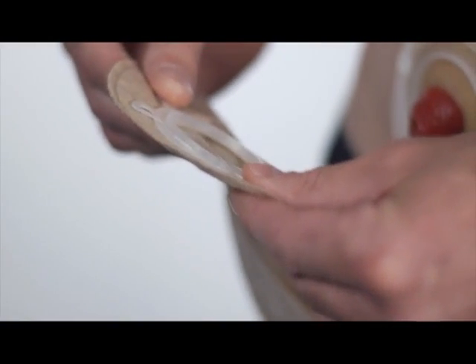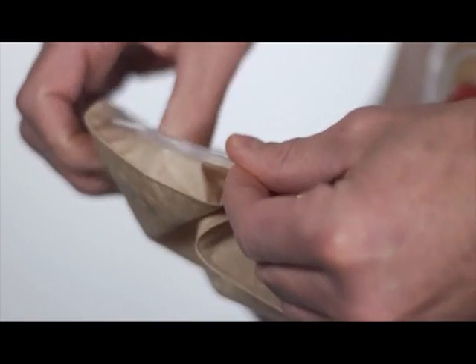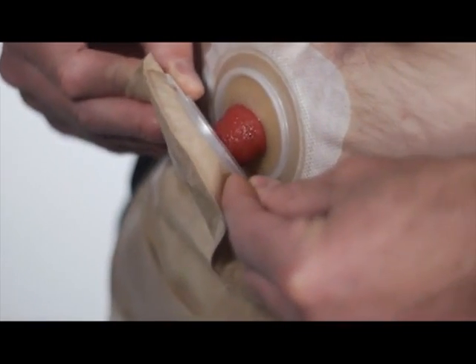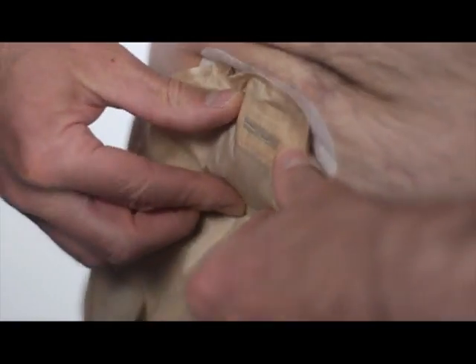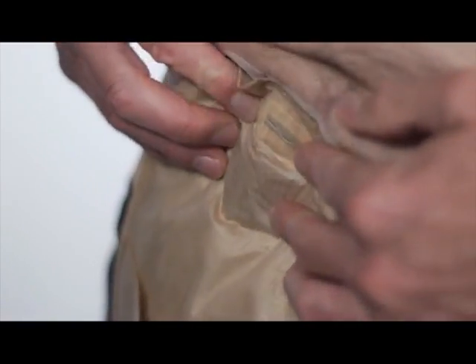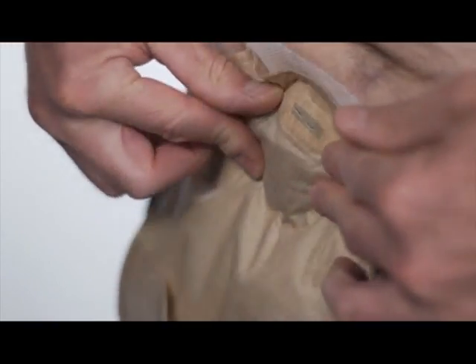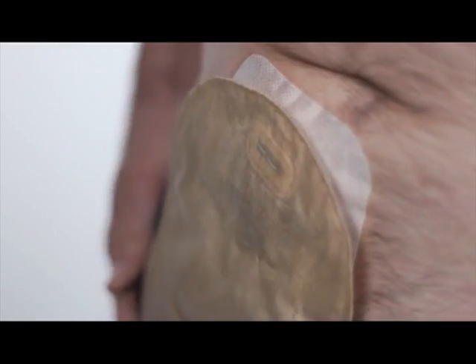To apply the pouch to the wafer, separate the inside front and back panels of the pouch so that the pouch contains a small amount of air. Position the pouch flange over the wafer flange. Gently press your fingers around the flange area, starting at the 6 o'clock position, and move your fingers towards the 12 o'clock position. You will hear and feel clicks as the pouch locks onto the flange.